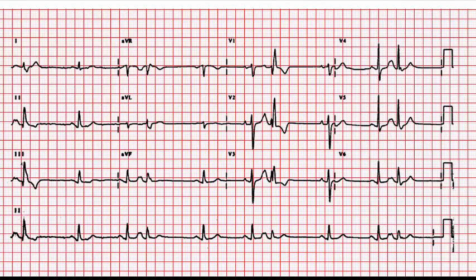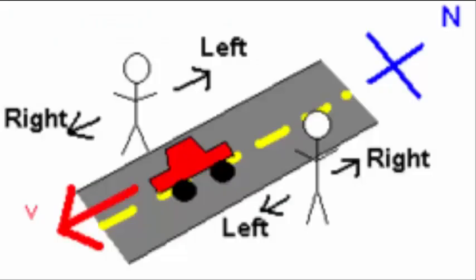This is the reason why we have different shapes of QRS in different leads, because they are recording the ECG from their own reference point. In layman's terms, we have 12 people looking at the same depolarization and repolarization phenomenon from 12 different angles, and therefore 12 different shapes for the ECG in each lead.